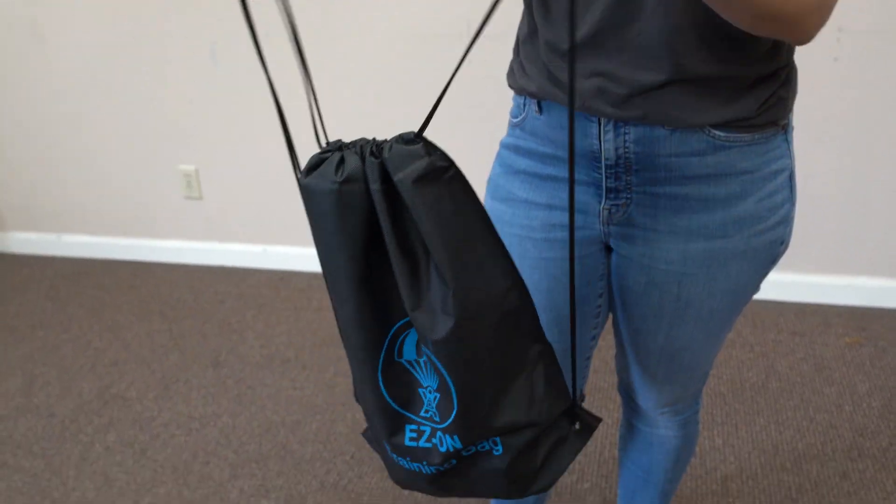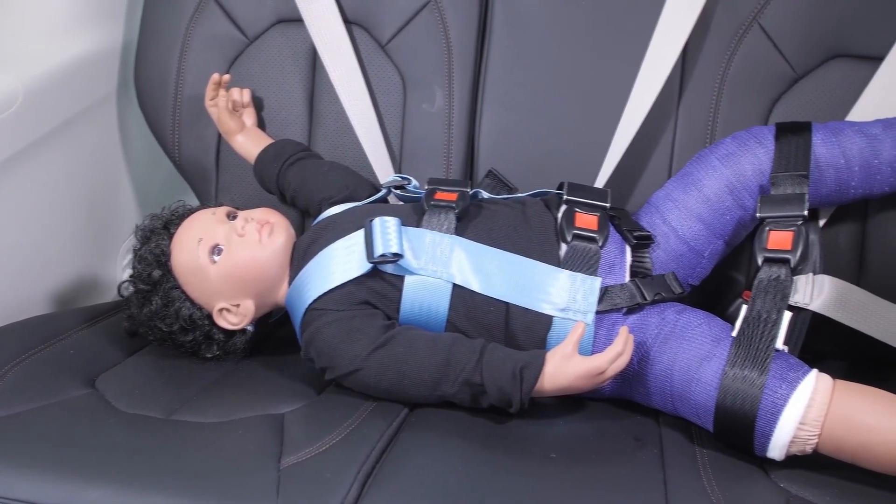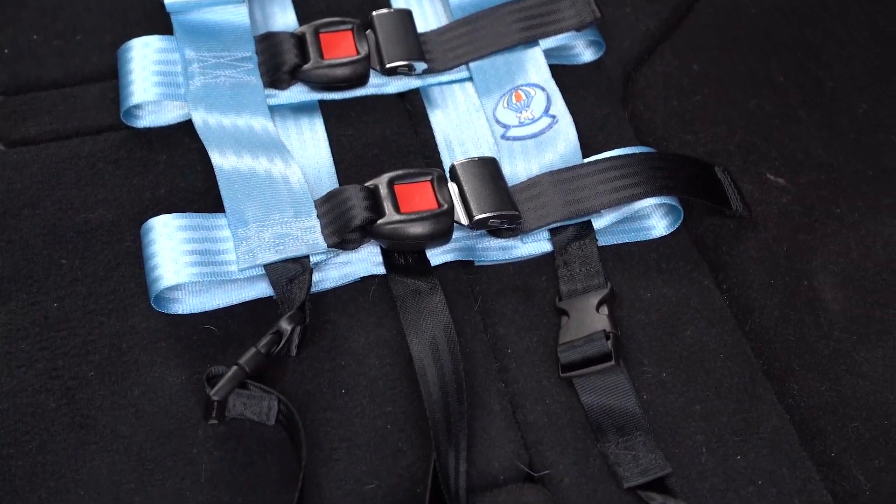and can be easily moved from one vehicle to another. No mount is needed and it can be used in all types of family vehicles. Custom sizing is also available.